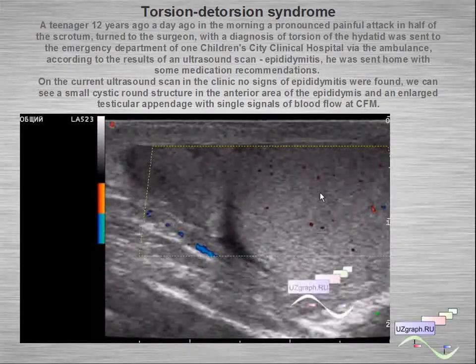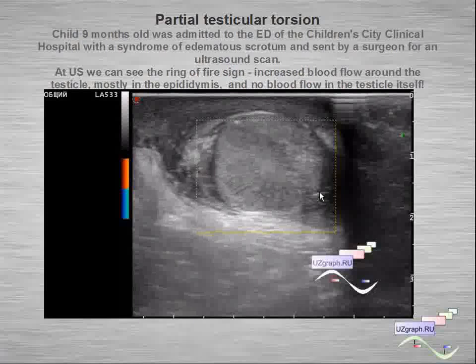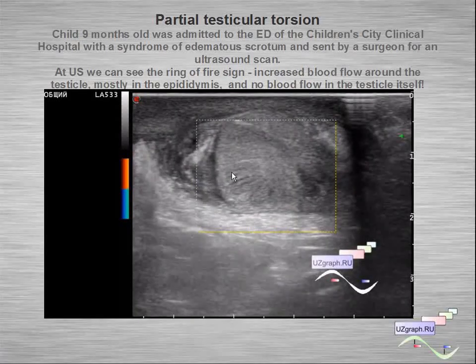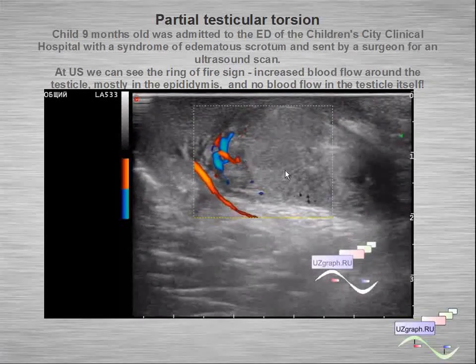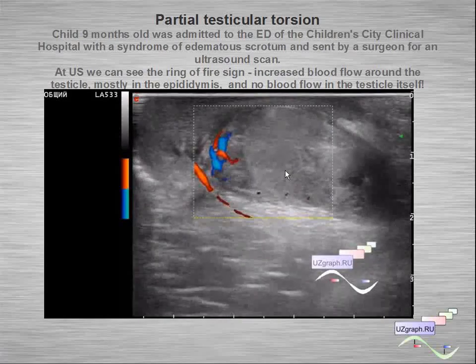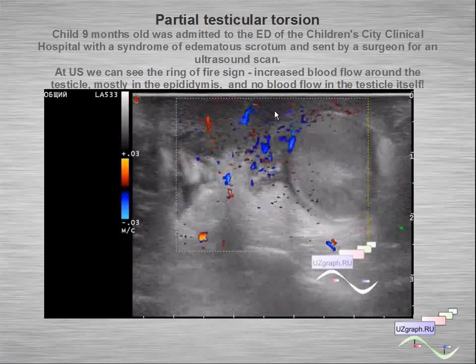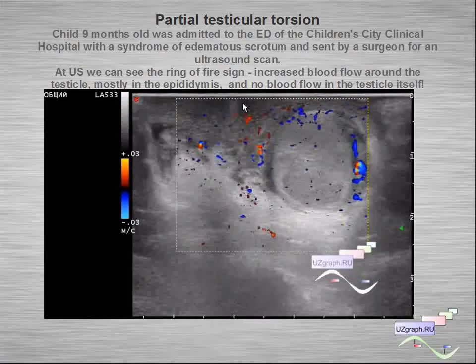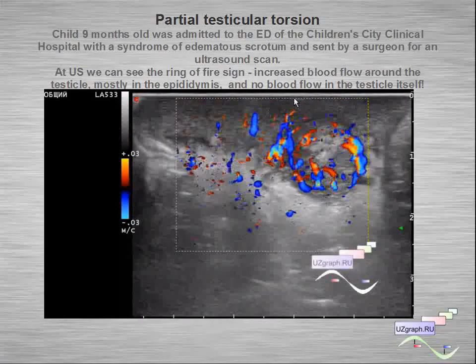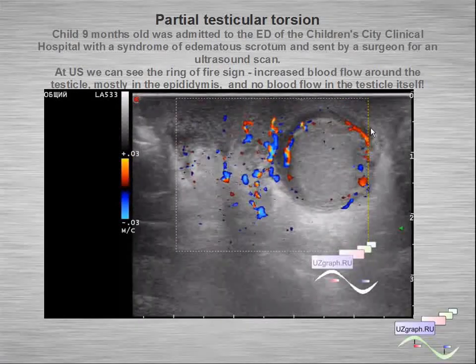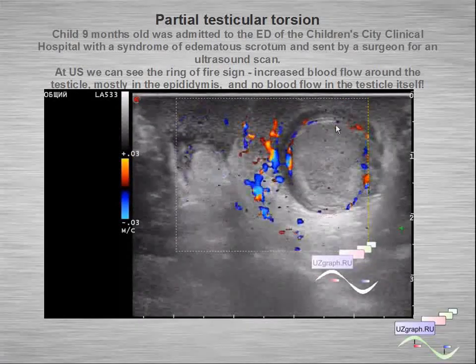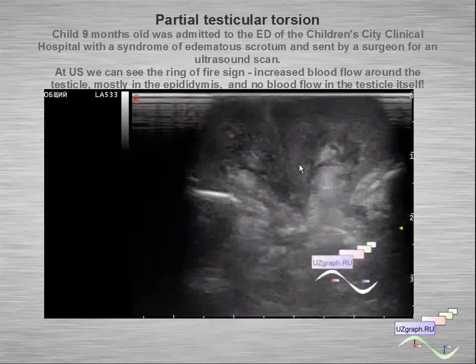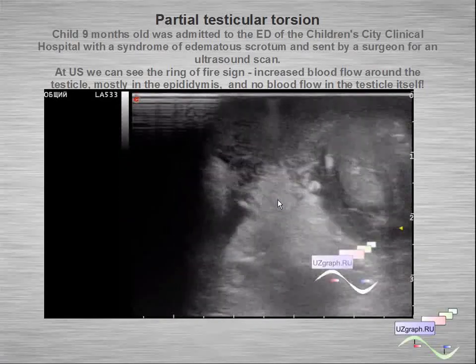Another example: this is a partial testicular torsion. We can see increased blood flow around the testicle — a ring of fire around it — and no blood flow inside the testicle.